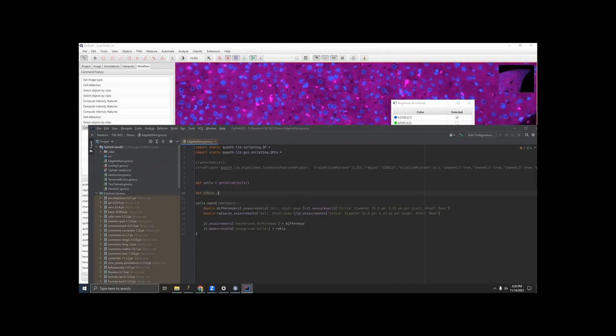So I'm going to make a new variable called channel name. And at first I'm going to call it AF647 and I'm going to spell it right because that's important. And then anywhere in here that I see AF647, I'm going to end the string, write plus channel name, and re-begin the string. And this is another nice feature of Groovy that isn't true in a bunch of other languages. You certainly couldn't do this in MATLAB, where to concatenate strings, it's just plus, and you don't have to do anything particularly fancy to replace string characters with a variable.